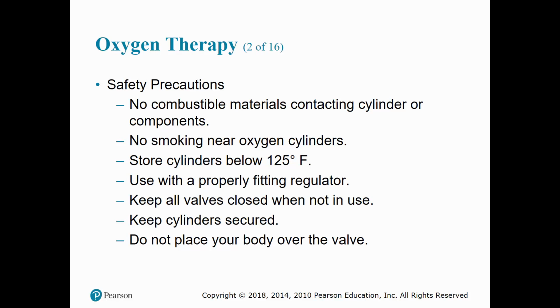A full cylinder is at 2000 psi, so if the tank becomes punctured or if a valve breaks off, an oxygen cylinder can accelerate with enough force to penetrate concrete walls. And a loosely fitting regulator can be blown off the cylinder with sufficient force to decapitate a head, penetrate the body, or demolish any objects within its path.